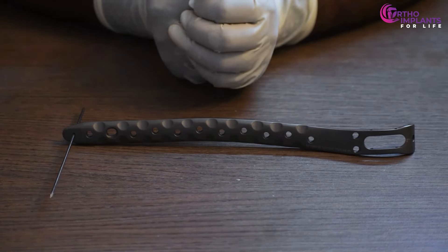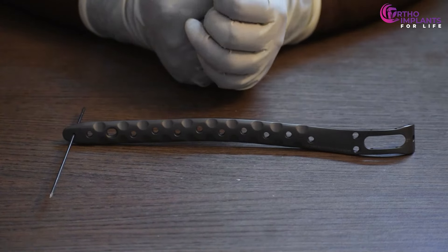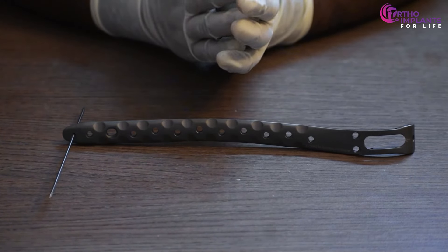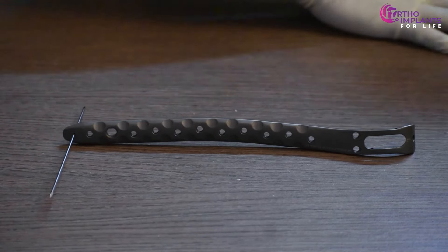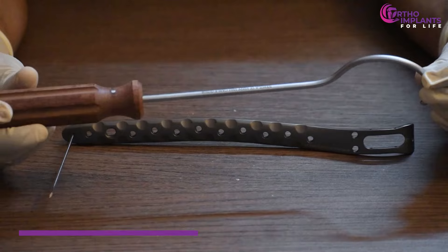For any periprosthesis case, it is important to first lock the cable before the plate fixation. Now to do the cable lock, we first need a cable guide.